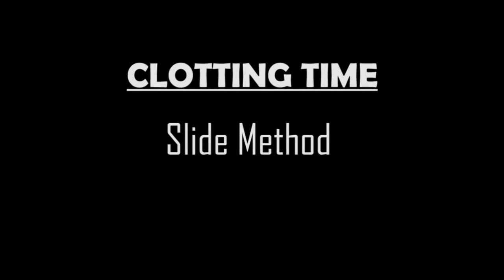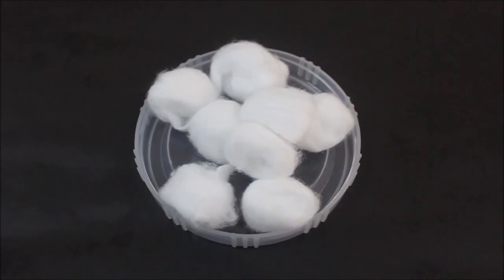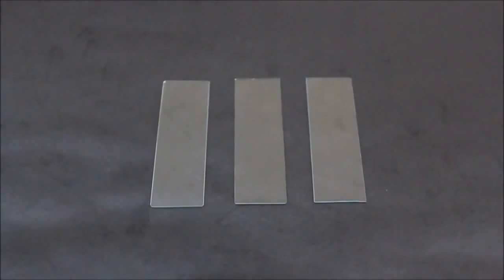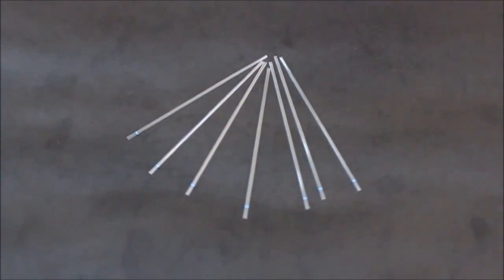Clotting time is the time required for the formation of the first fibrin strand. For the slide method and capillary method, you need a lancet, cotton, 70% alcohol, timer, clean glass slides for the slide method, and non-heparinized capillary tubes for the capillary method.